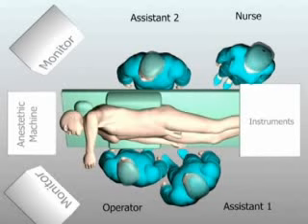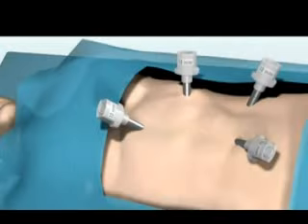Four trocars are required to safely perform this operation. With the patient in the 0-degree position, the first trocar, the camera trocar port, is placed in the supraumbilical region. The further ports are positioned in the subxiphoidal region 2 cm below the xiphoid and in the medioclavicular line 2 respectively 10 cm below the subcostal margin. The three ports are positioned under visual control through the 0-degree laparoscope.